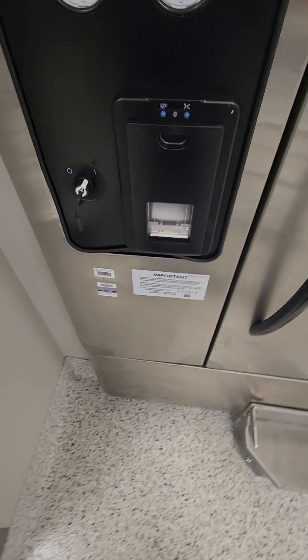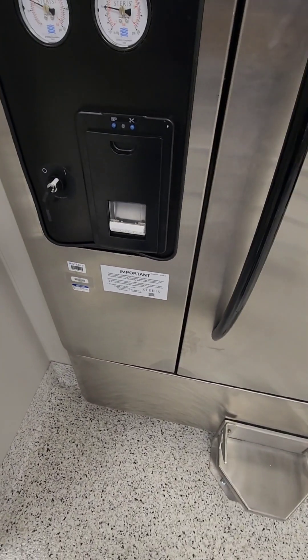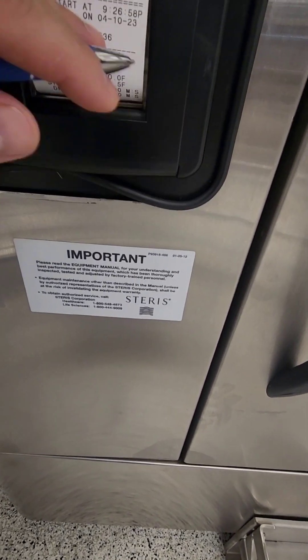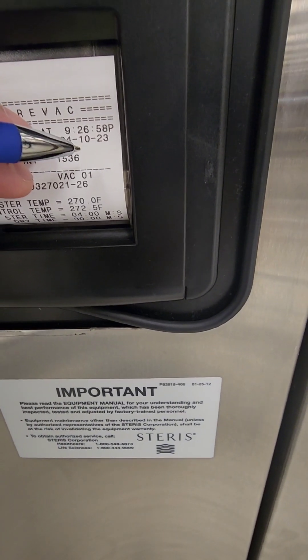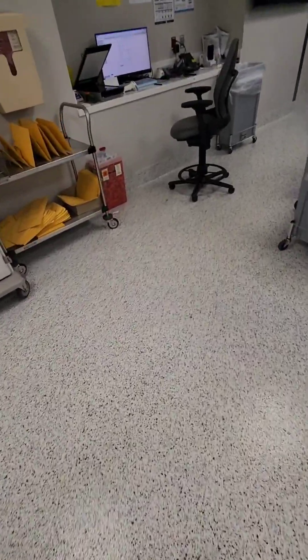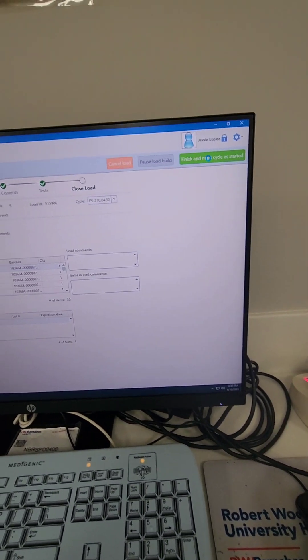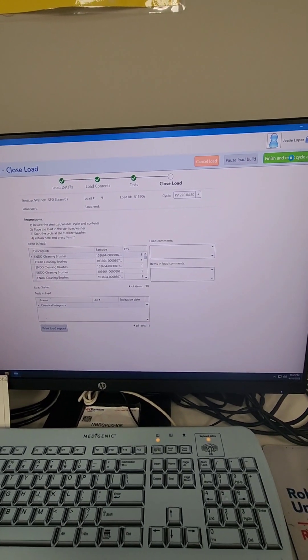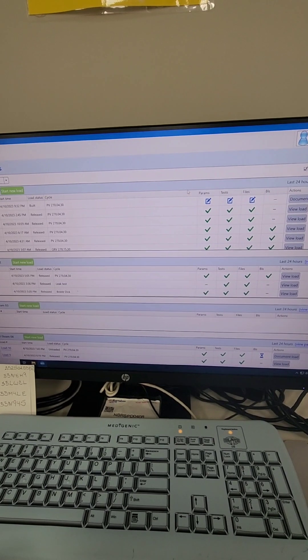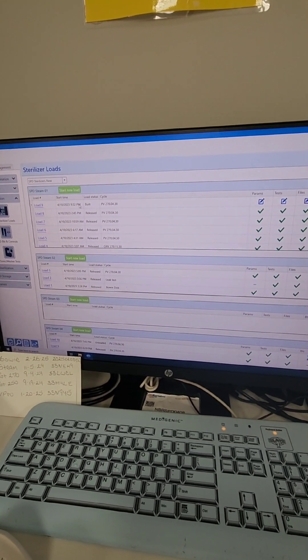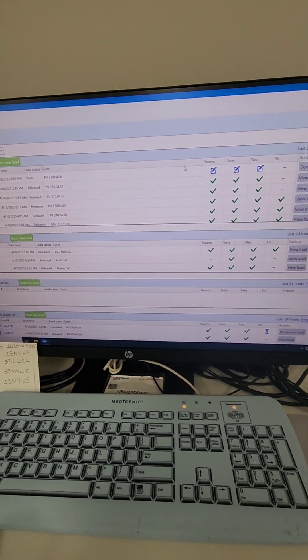The printout will start coming out and you want to initial the top of the printout because you just started this load — there you go, my initial is on it. Unfortunately, my sterilizers are not integrated with the tracking system yet, so it's not going to automatically confirm that the load has been started — I have to manually do that. When it's integrated, it will do it automatically. And that's it, guys — that is how you start a sterilization load in an automatic system. As always, stay true to yourselves, keep it 100, continue educating yourself. Till next time, peace.